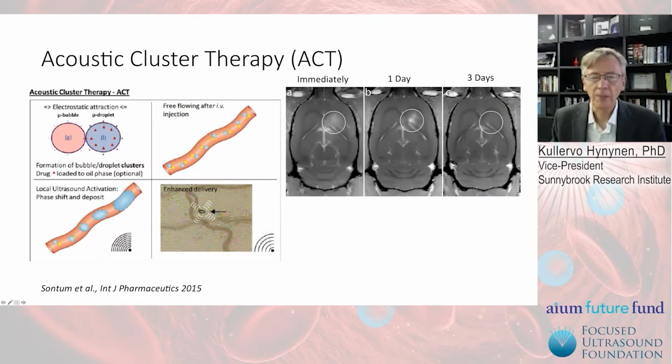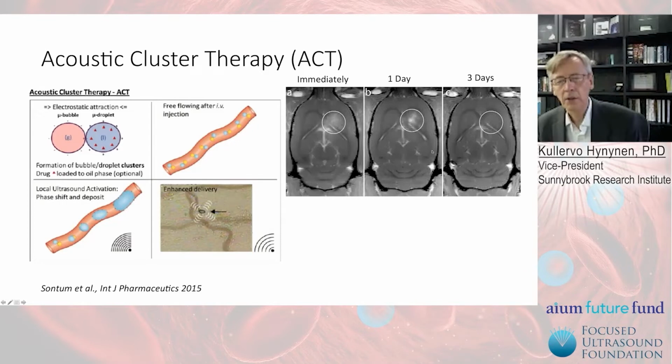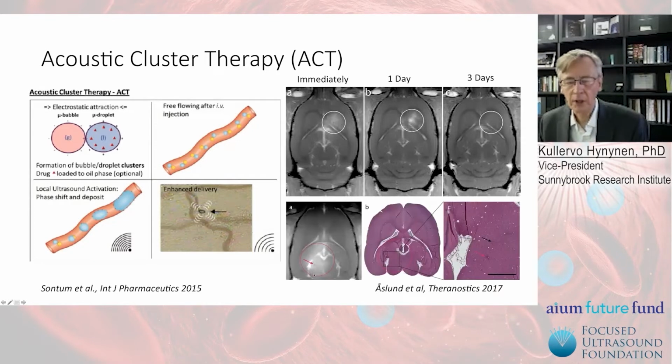And here is an example demonstrating blood-brain barrier opening immediately after sonication. So these seem to be working quite nicely. It's still open at 1 day, although less so, and at 3 days it seems to be completely healed. They also did histological studies which didn't show any significant amount of tissue damage.